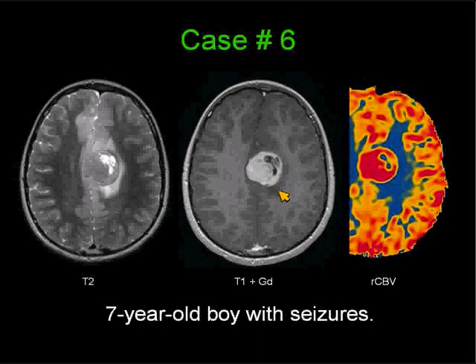Another pediatric case: a 7-year-old boy with seizures. You are shown an axial T2-weighted image on the left, on the center a post-Gadolinium image, and on the far right a cerebral blood volume study from the MRI perfusion study.